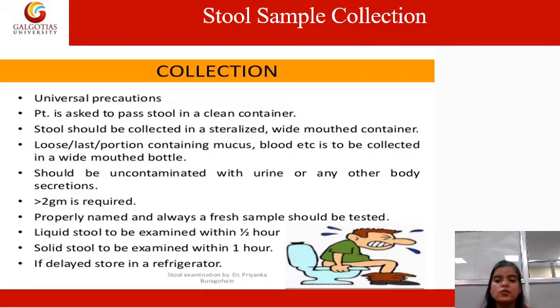So make sure when you are collecting the stool sample, it should contain only the stool, not other specimens. At least the amount required is more than 2 grams. Properly name it: whatever sample we are taking, we have to make sure our identity is properly written over there.